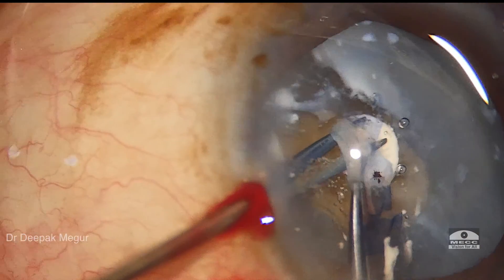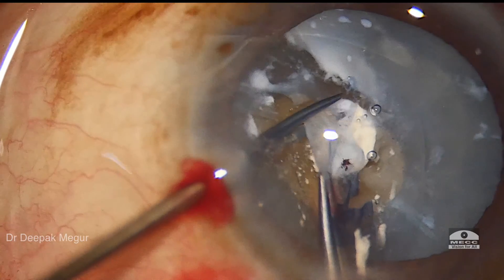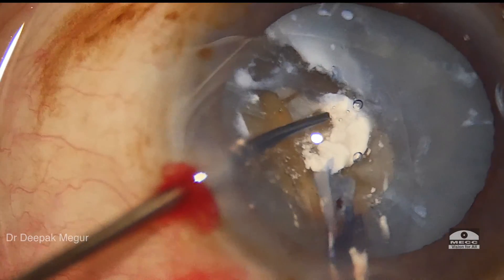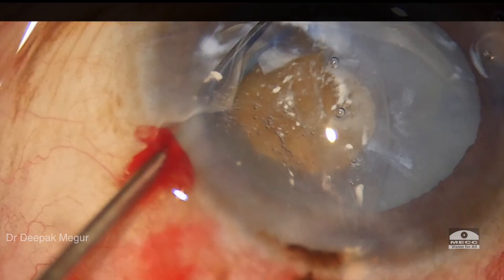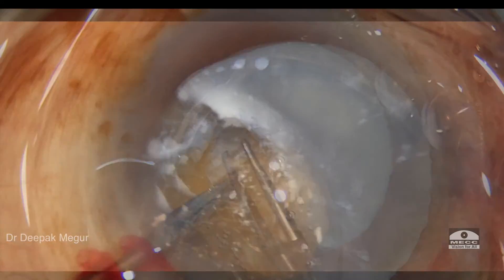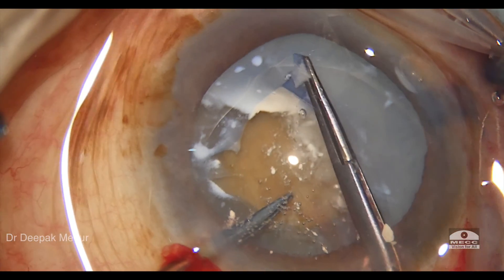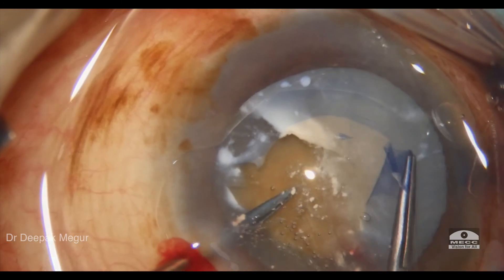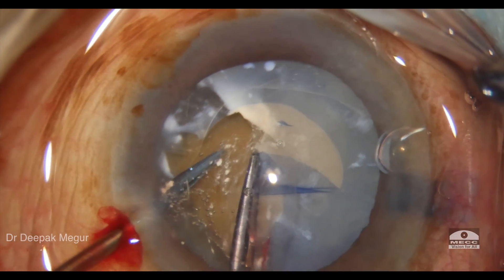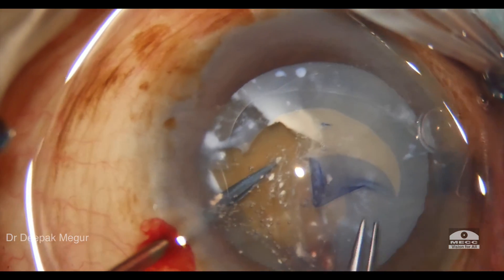I'm using my scissors to cut the adhesions between the overlying capsule and the calcified plaque. The micro scissors and forceps are a great tool, and once the plaque is removed I'm trying to negotiate the capsule and create a rhexis. It's very clear that the capsule behaves in an entirely different way in zones where there is no calcification.